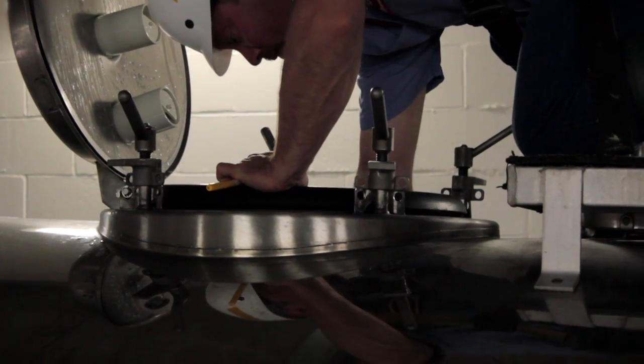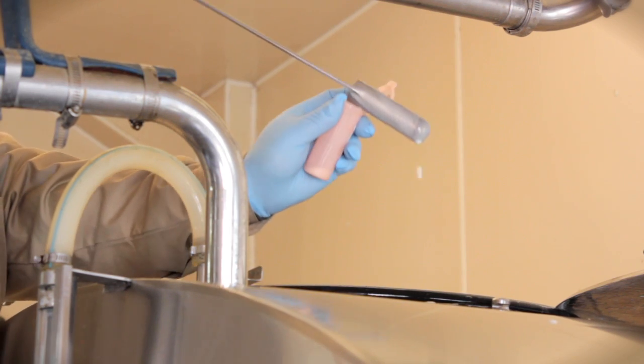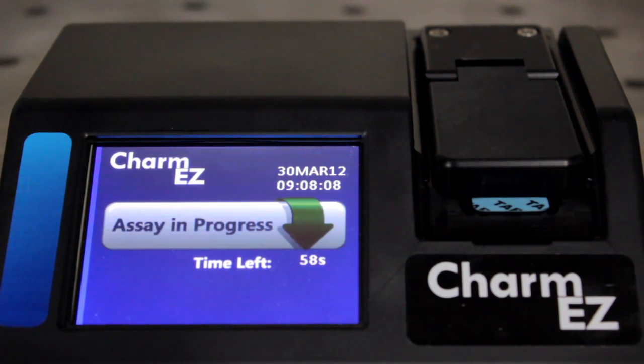It's a simple process. All you need is a ROSA strip, pipette, and milk sample. The Charm EZ is the only combined incubator-analyzer system that can display results as fast as one minute.